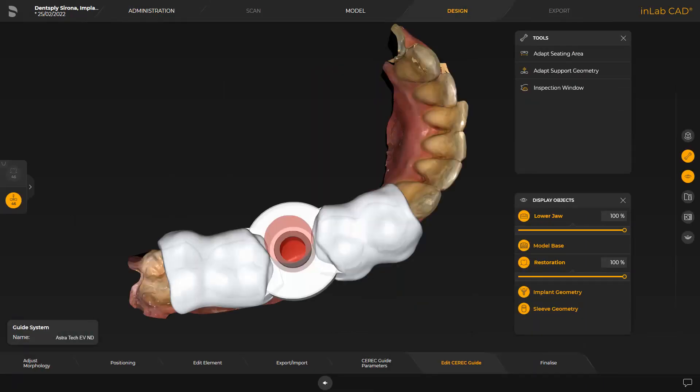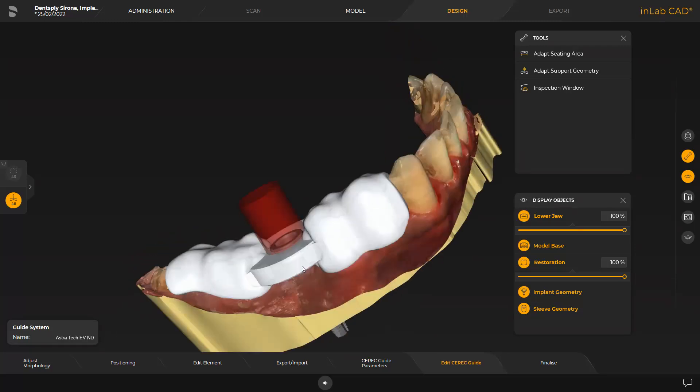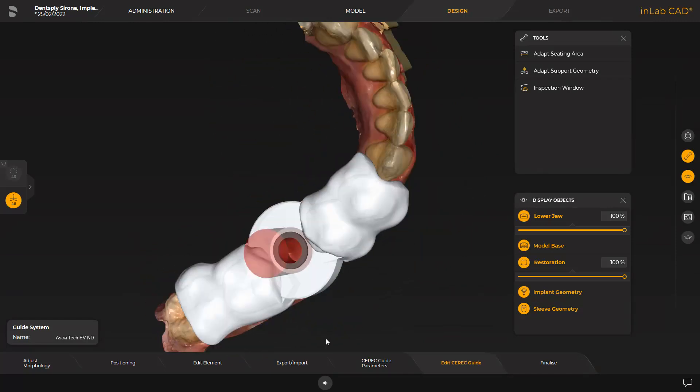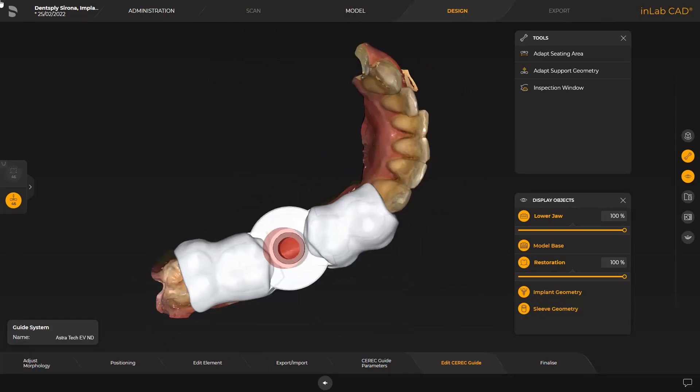After switching to the model phase, an initial design proposal is displayed. In our case, we are planning a CEREC guide 3. The design workflow for a CEREC guide 2 is the same. The surgical guide includes two adjacent teeth, mesial and distal respectively, if present. Before we proceed with the tools, just for demonstration purposes, we go back to the CEREC guide parameter for the first step.